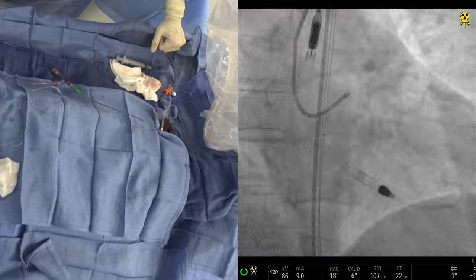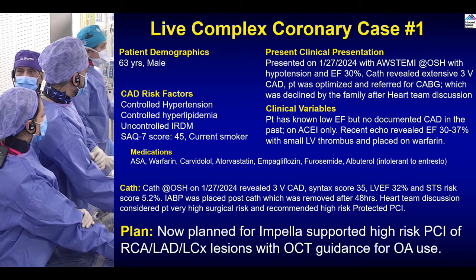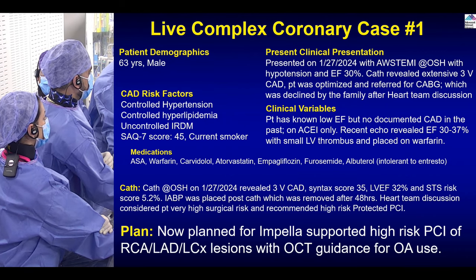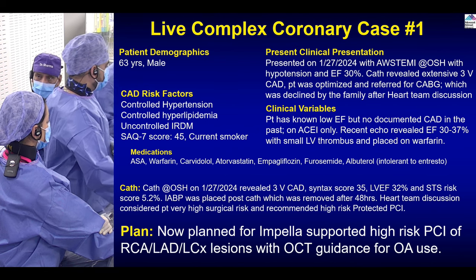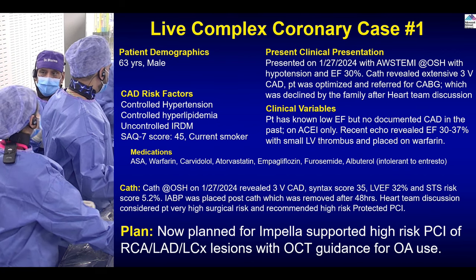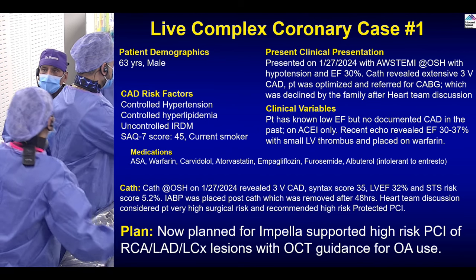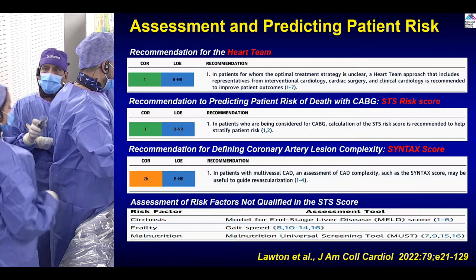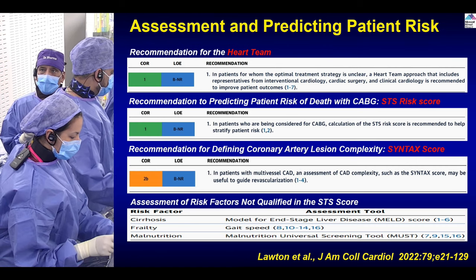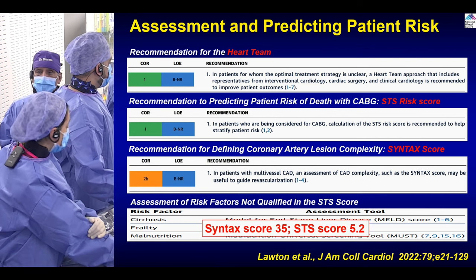Let me complete the presentation. The plan is supported high-risk PCI of multiple lesions with OCT guidance. There is calcium, but it seems on angiogram to be in the area of non-obstruction — ectatic and calcified, but the true lesion in both circumflex and LAD is without calcium at the site of stenosis. This patient's syntax score is 35, STS was 5.2 at that time — probably lower now, around 3, since at that time the patient was near pre-cardiogenic shock with a balloon pump.